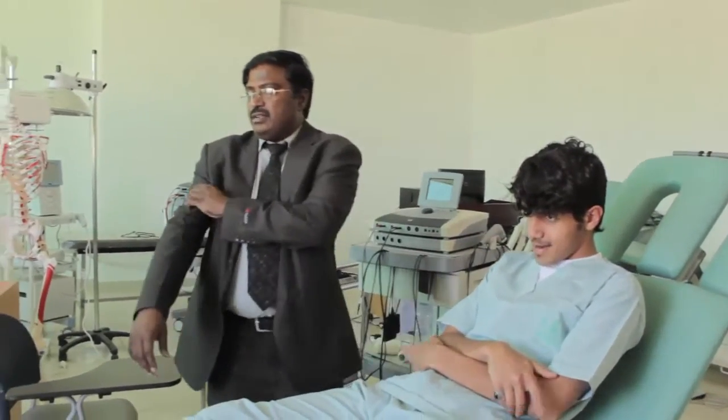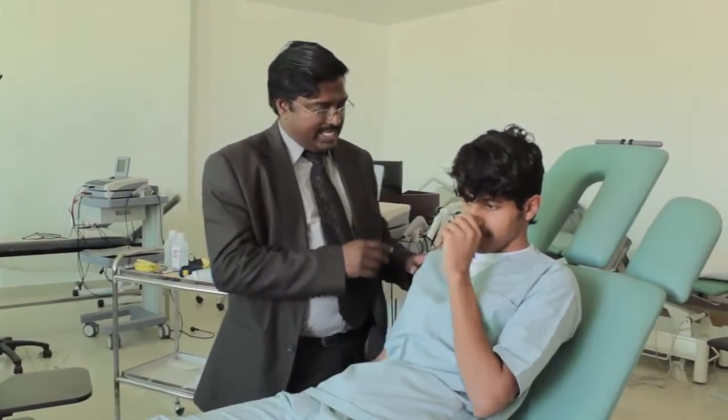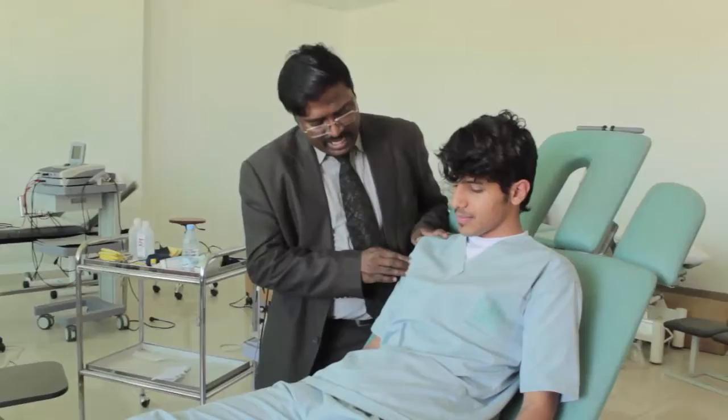Now, the common conditions, common places where you keep this particular current. There are some common conditions which you see in your physical therapy practice, like bicipital tendonitis. You know biceps tendon, biceps muscle? The biceps tendon is here. It goes and inserts into the shoulder, above the glenoid fossa it gets insertion. So the tendon comes here.